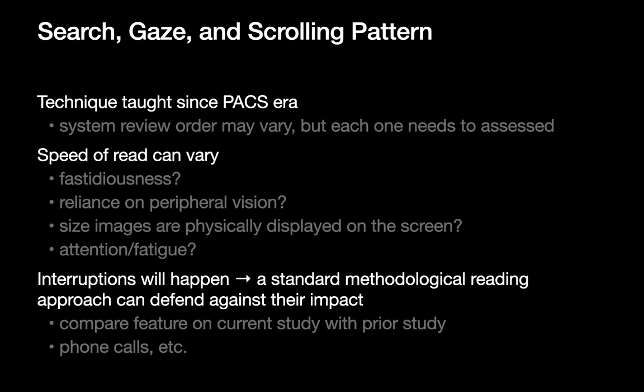And that's the way a chest CT can be read. Reviewing a chest CT by system is generally how most folks have been taught to read chest CTs since the PACS era began. The order in which we read various organ systems may differ from person to person, but the general concepts of what we look at and how we look at them are relatively consistent. There may be differences in how quickly folks review a chest CT, related to factors such as how much you rely on peripheral vision, how large you display the CT images, your level of fastidiousness, and your level of fatigue. Having a standard approach to reading a chest CT is extremely helpful in minimizing the impact of interruptions on your read.